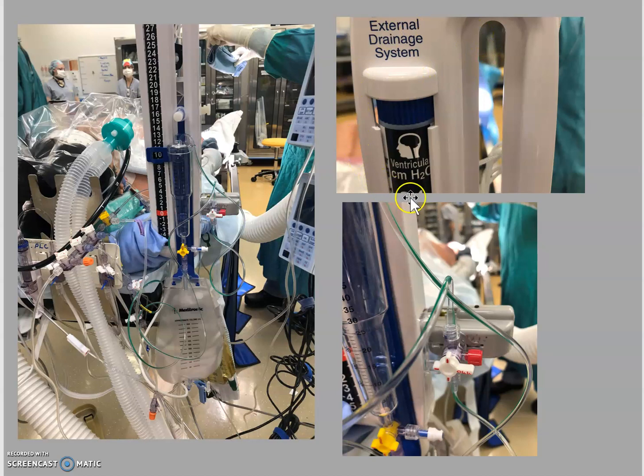The drain setup you'll be using will read 'ventricular' at the top and is measured in centimeters of water — we usually set it to about 10. There are two sets of stopcocks: the red stopcock on the side, which you open and close for direct drainage, and the little yellow stopcock, which you close off to the patient once you've collected your hourly drainage.